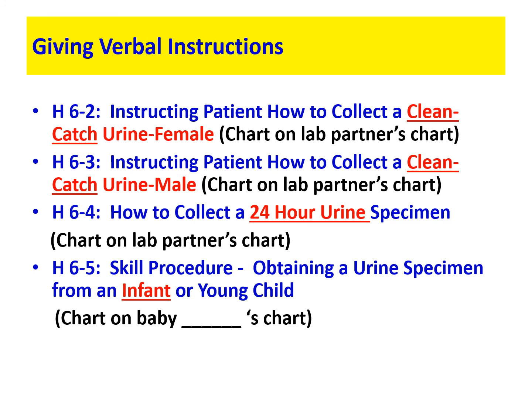So make sure you read through all these and check off all the boxes on page 80 dealing with that. Now, you guys took home urine containers and 3 moist towelettes so that you can collect a clean catch urine on yourself, okay? So make sure that you do that so you can bring that into class on Wednesday, and we can do H6-6 on the analytical test of chemical urinalysis using reagent strips, okay?